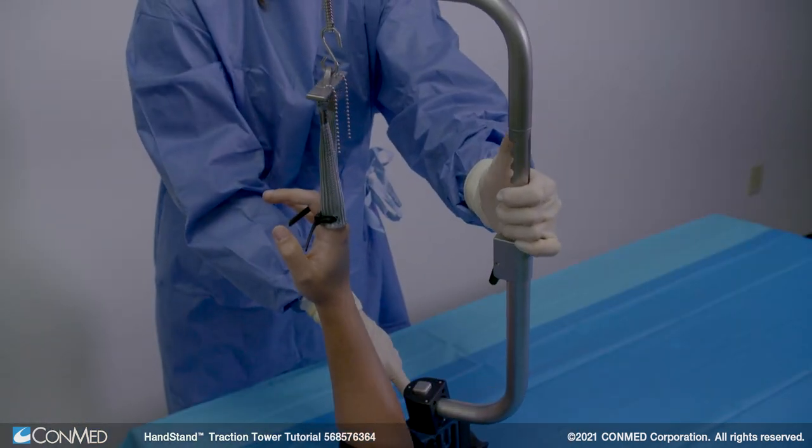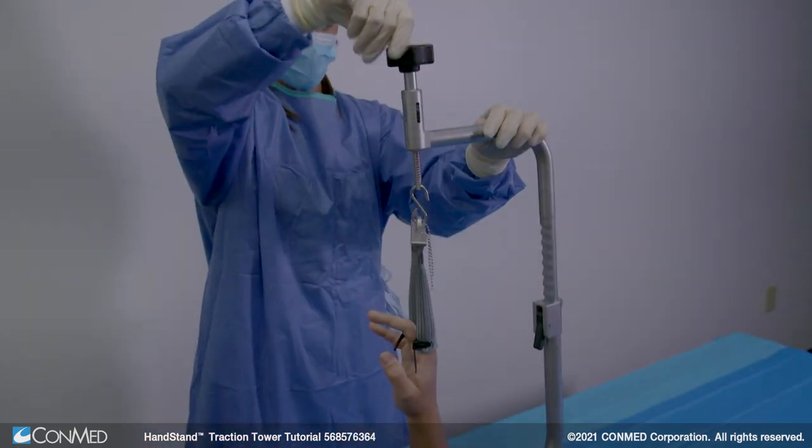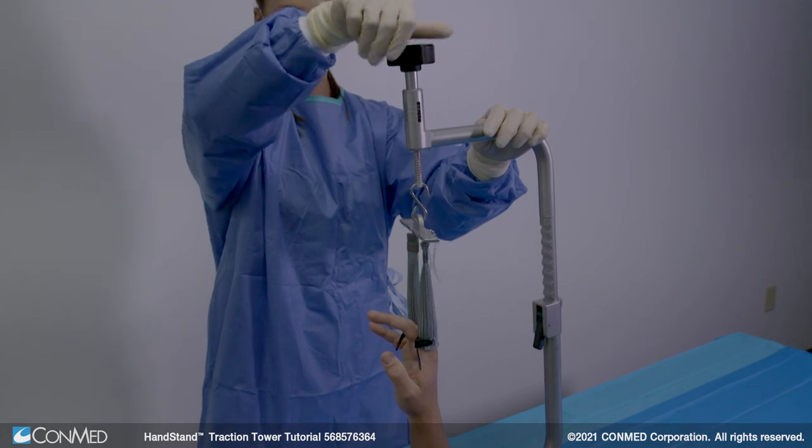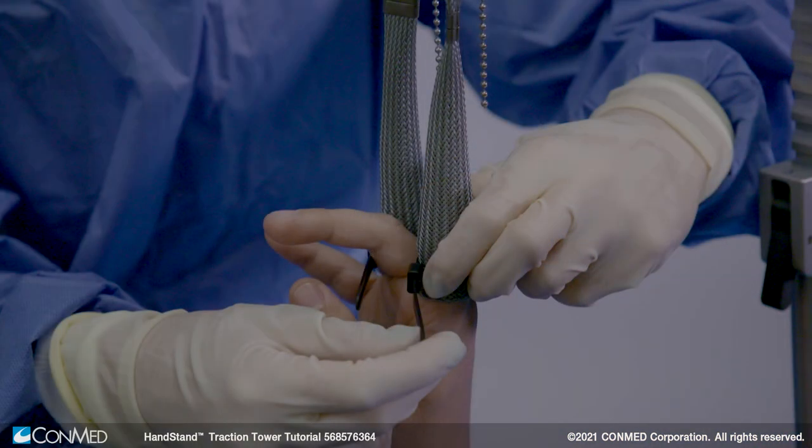Traction can now be adjusted to achieve desired distraction. Micro-adjustment can be made by adjusting the knob on the upper arm. A reference to the amount of traction will be displayed on the scale in 5-pound increments up to 20 pounds.